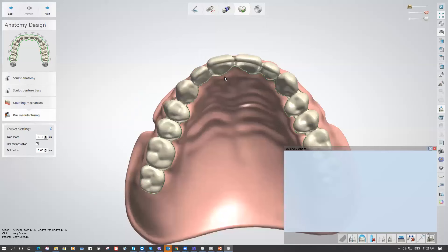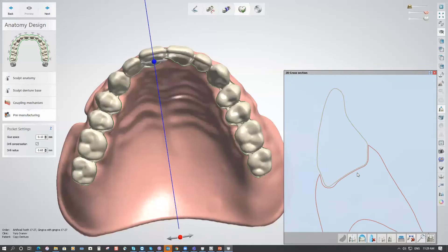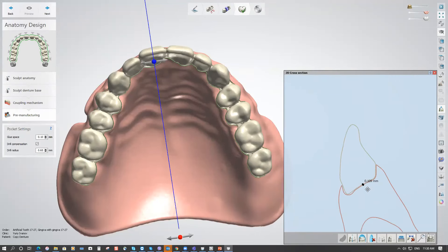Add the teeth back and do a cross-section at the central incisor, for example. Extend it to see the glue space created by the software — the depth is 0.1 mm (100 microns). If you want to change it, you have the option to increase or decrease it according to the glue material you're using, and the drill radius is also applied to ensure it is millable.